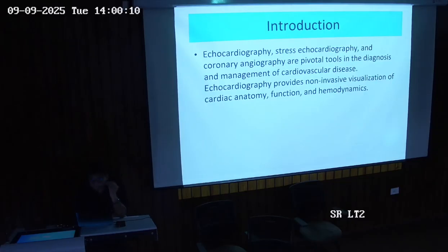Cardiovascular diagnosis requires a step by step approach. So echo is structural and functional. Stress echo uncovers the ischemia and angiography defines the anatomy. So echocardiography, stress echo and coronary angiography play pivotal roles in the diagnosis and management of cardiovascular disease. Echocardiography provides a non-invasive visualization, while CAG and stress echo, by the use of pharmacological maneuvers, may be invasive procedures.